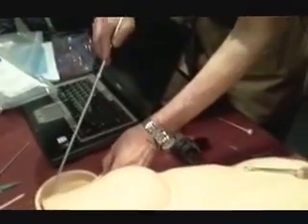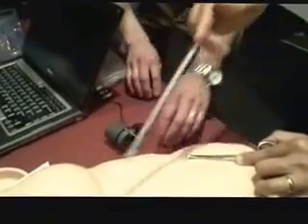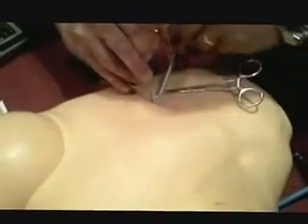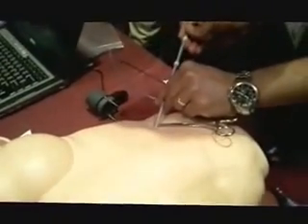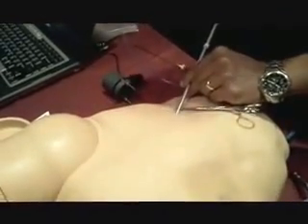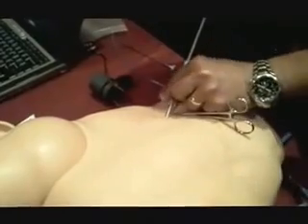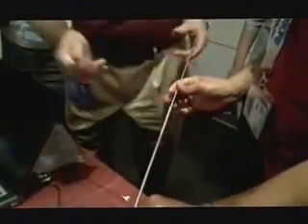Now as you advance this, hold it about in the middle. What's the incidence of catheter malfunction with this technique? It's about 10%. The catheter malfunction on one hand, because ours are — some just put them in blindly — and they check them when they put them in. But once it's in, if it's put in blindly, we should be checking them at the time. You'd want just a fluoroscopy? Yes, because actually you can reposition it.